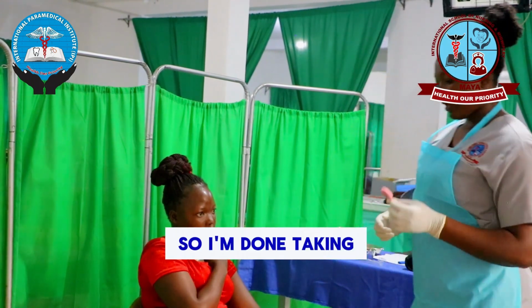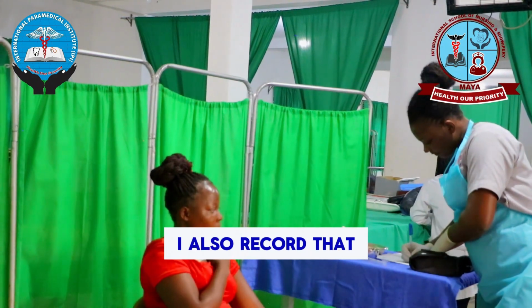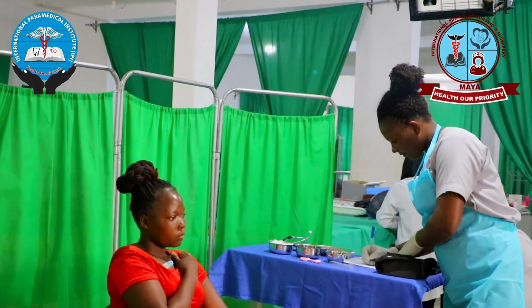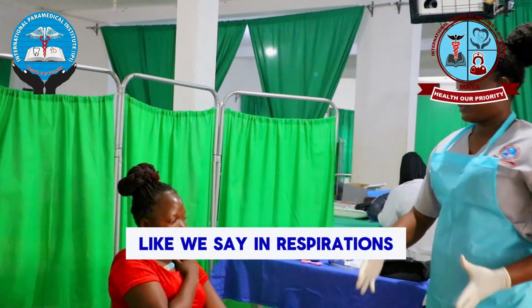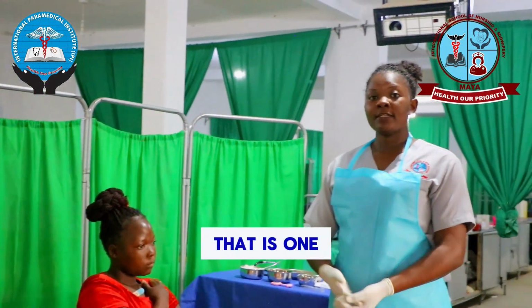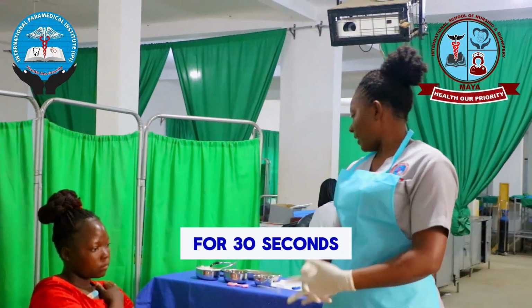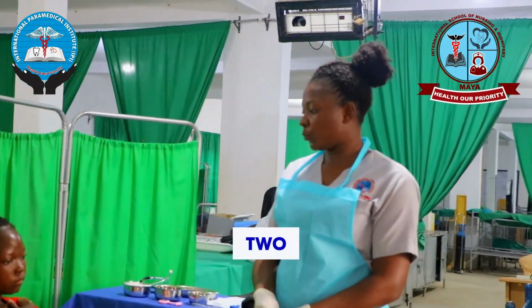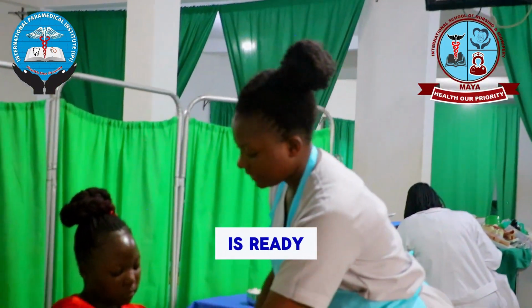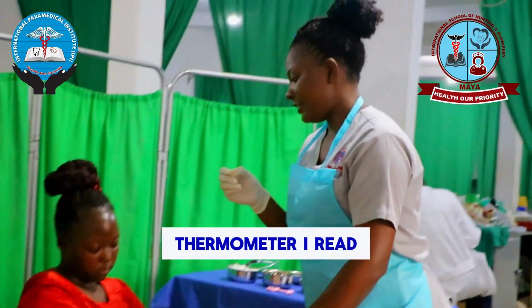So I'm done taking her respirations. So before I continue, I also record that. Like we say, in the respirations, you see the chest moving in and out. That is 1. So I have timed for 30 seconds, and then I multiplied my results by 2. So I'm sure by now the thermometer reading is ready. So I remove the thermometer, I read.